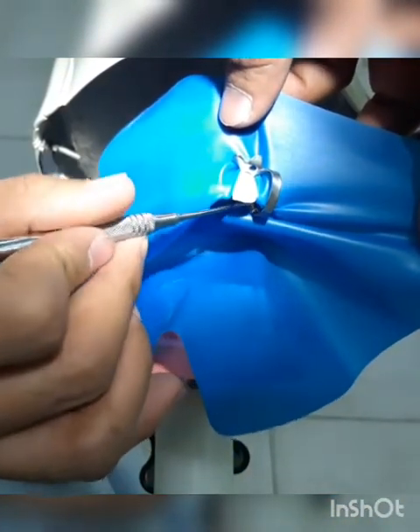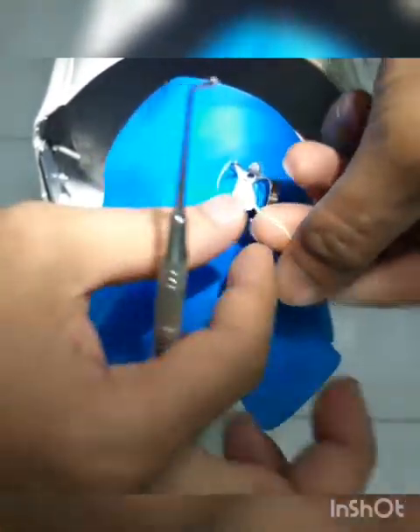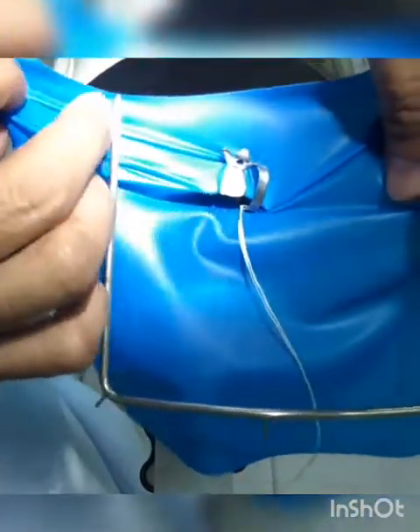Then you need to get your floss to secure your clamp, and then of course secure it with your frame.